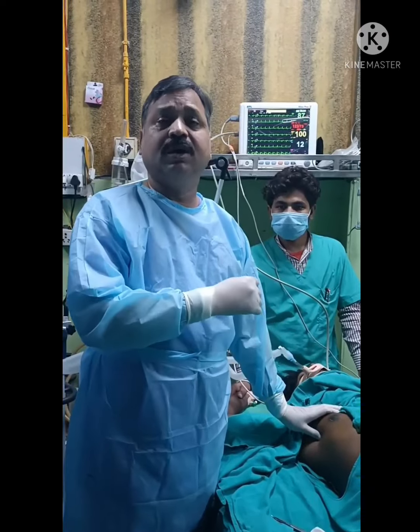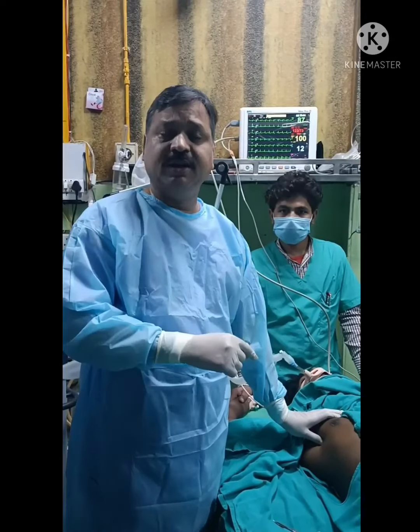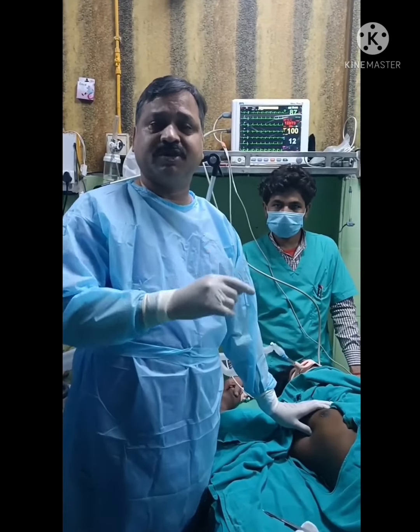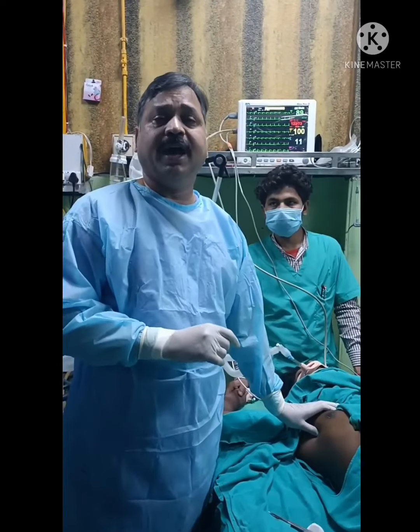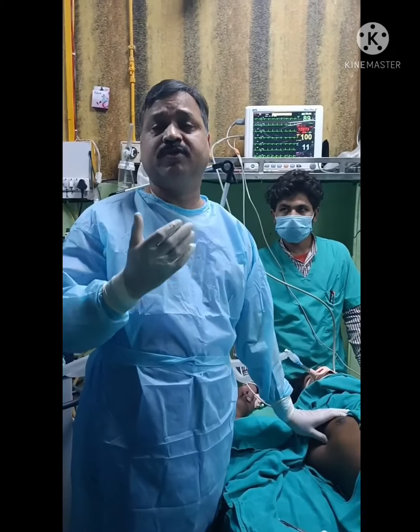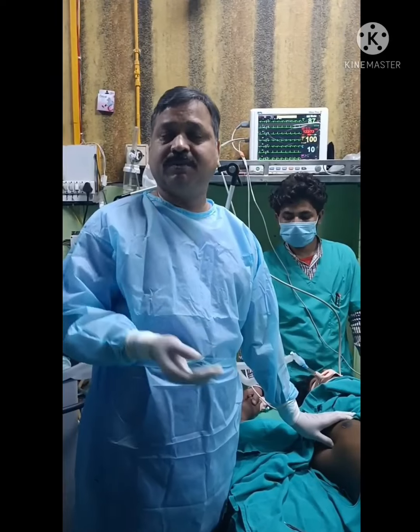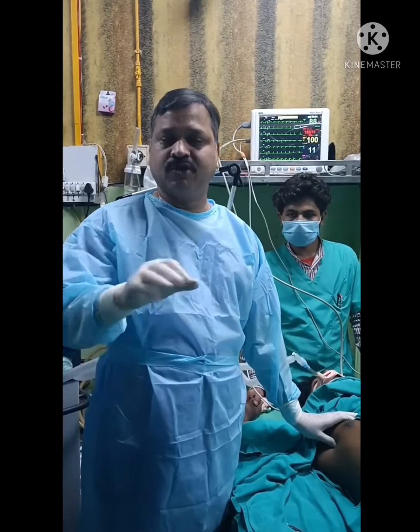The patient is of trauma with head injury with traumatic hemothorax right side, and he is on a ventilator. So he was bleeding, his blood pressure was down. We have given him 2 units of blood, 2 units of plasma, and now we have decided to put the chest tube. See, the initial treatment of hemothorax is not the chest tube, but to resuscitate, to bring up the blood pressure, transfuse blood, and then if it is still bleeding, put the chest tube.